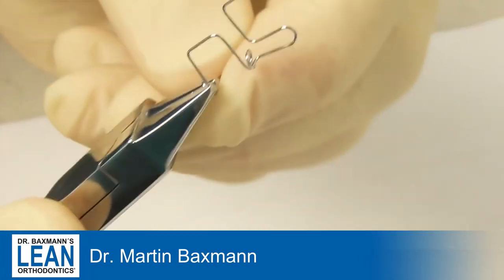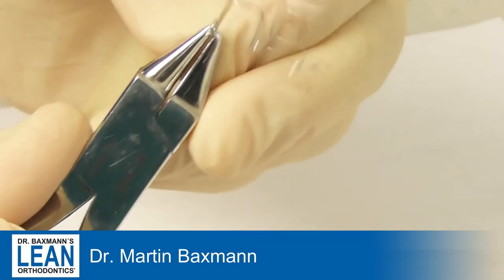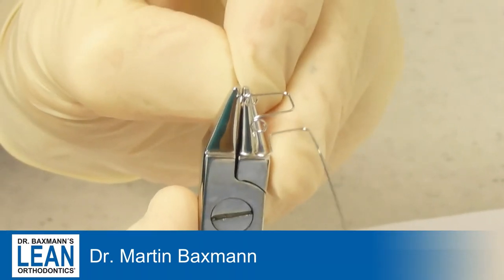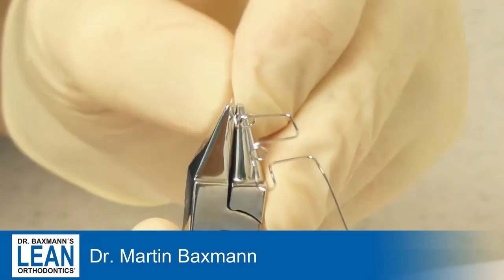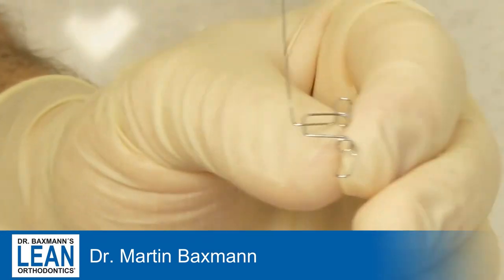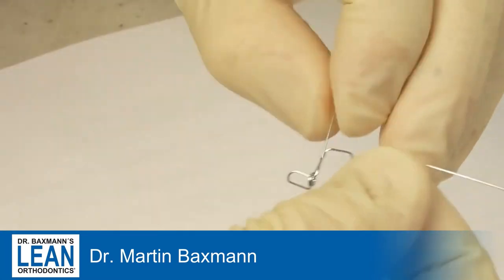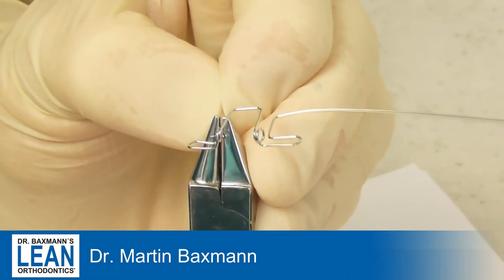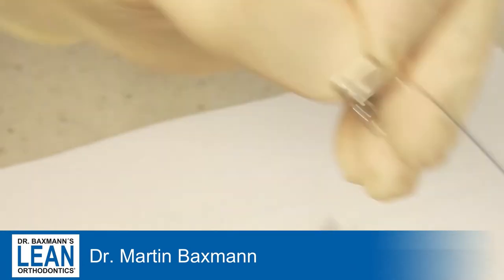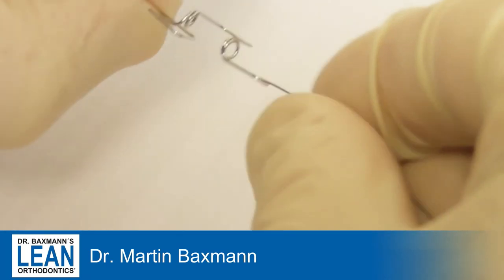It's quite a complicated bend. If you know my concept of standard and hero cases, this obviously is a hero case — but as we say in Germany, it's the salt in the soup, what brings some spice to the ordinary routine work. Now you can see how it looks: it's like a mega T-loop on both sides with two helices as well.